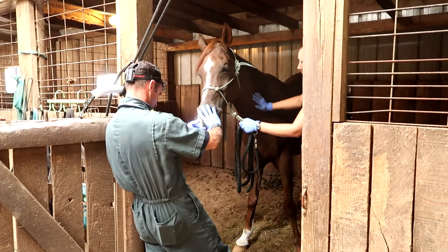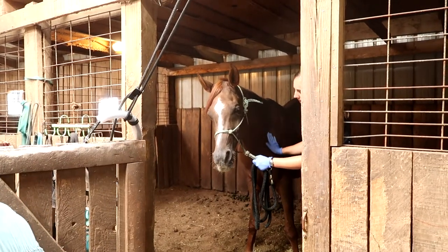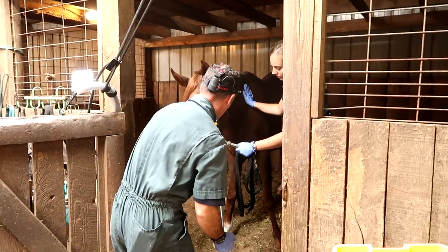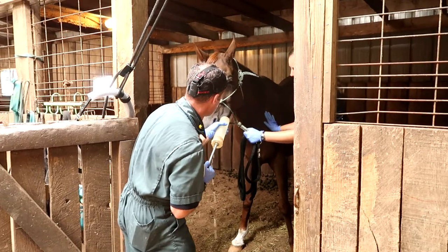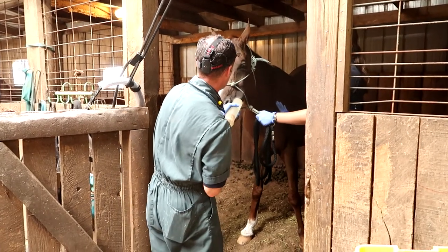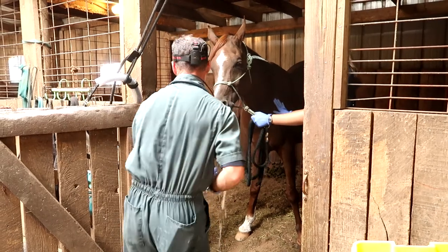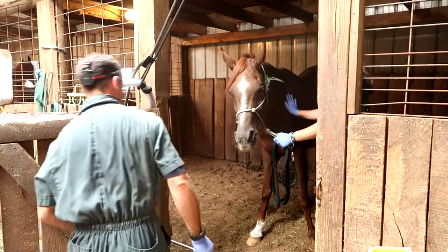Okay, so this is Dr. Scott. He's our vet that comes out once a year to float our horse's teeth for us. He's a great vet — super patient and very educational. He's already given Tino a sedative here, which I did not video because Tino is very weird about having a vet out, and if he knows he's going to get a shot, he's a little crazy.